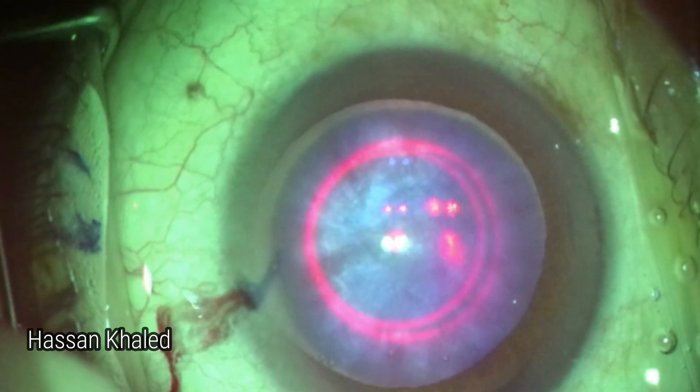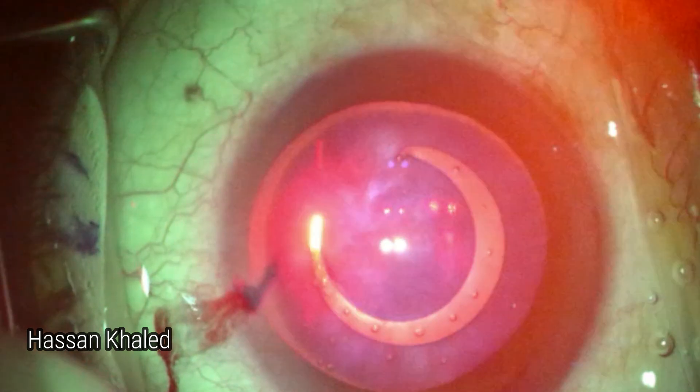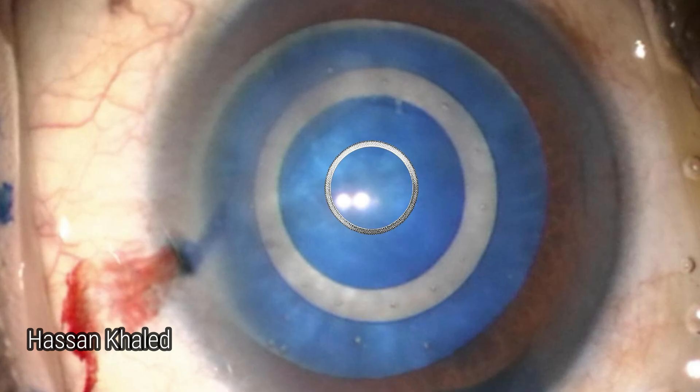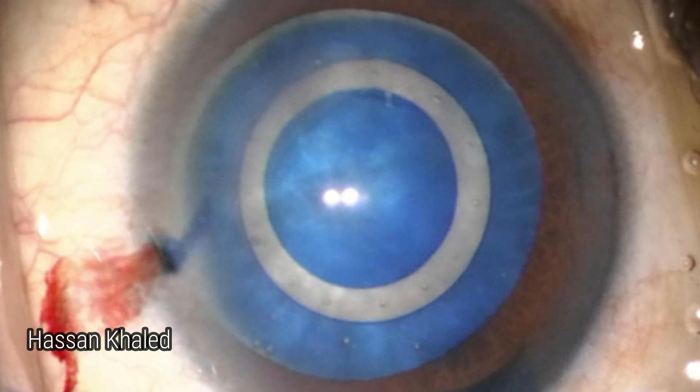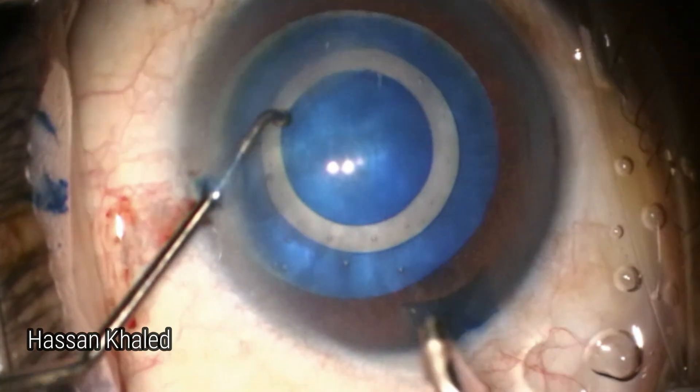Then applying the laser, which is 0.3 seconds. Here is in slow motion — look at the complete 360-degree cutting of the anterior capsule and the concentricity with the central three-band landmark. You can see the central disc.